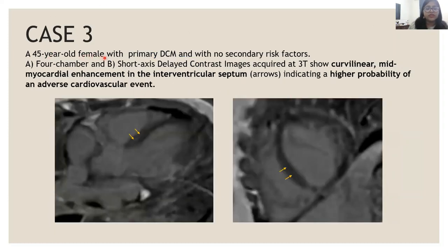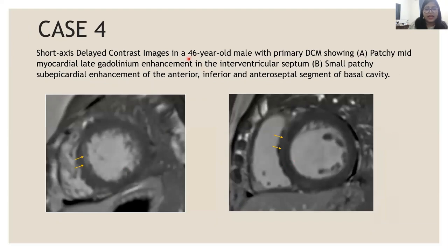A 45-year-old female diagnosed with primary dilated cardiomyopathy and no secondary risk factors — post-contrast images show patchy mid-myocardial enhancement in the interventricular septum. Additionally, a 46-year-old male with primary dilated cardiomyopathy shows patchy mid-myocardial enhancement as well as patchy sub-epicardial enhancement in the interventricular septum.